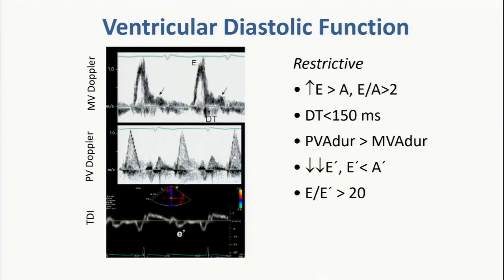And finally, an example of the restrictive pattern. Here, things have gone even more awry. The LA pressure is even higher.